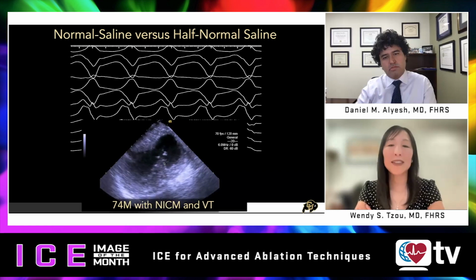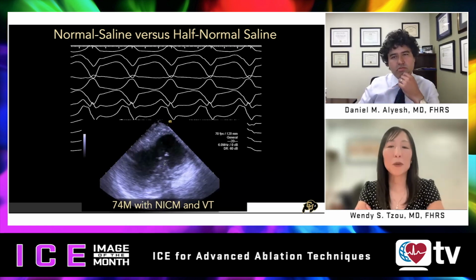In general because of the baseline history, but now I see this. How are we going to get to where we want to get with respect to substrate and depth of penetration with ablation with just the tools that we have?